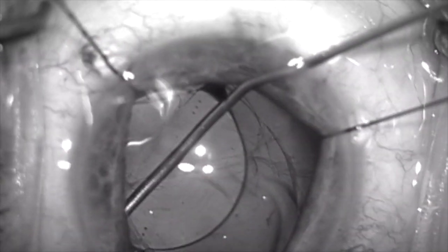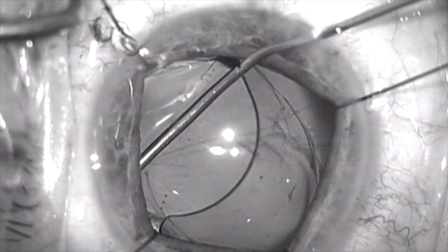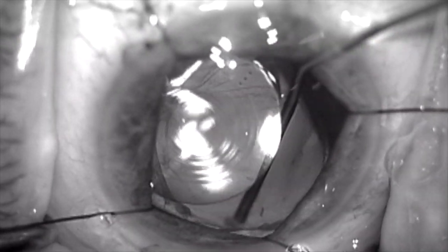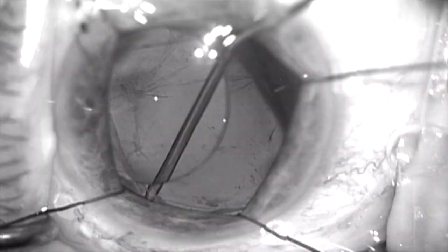I'm working my way around from each side because the capsular bag in the lower right-hand corner runs out a bit and I cannot see the extent of it. I suspect there might be a radial tear in that area at about 5 o'clock on the screen. So I'm trying to open the capsular bag here as much as I can, given that I cannot see completely out to the periphery of the anterior capsule extent in this area.